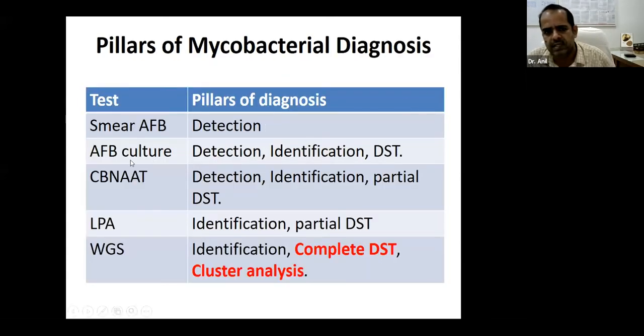So again, pillars of mycobacterial diagnosis. Smear AFB is only for detection.